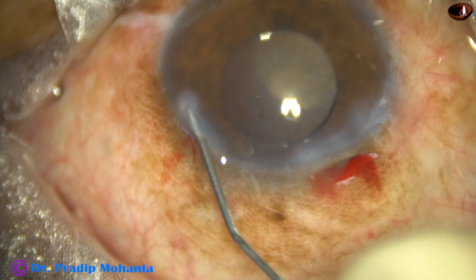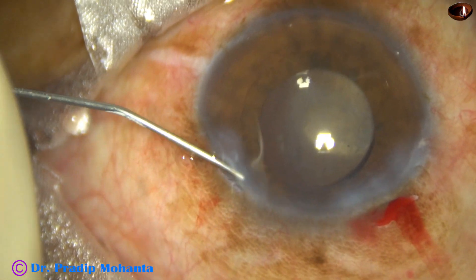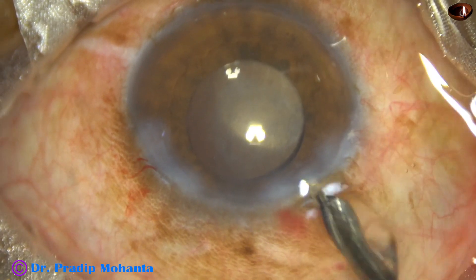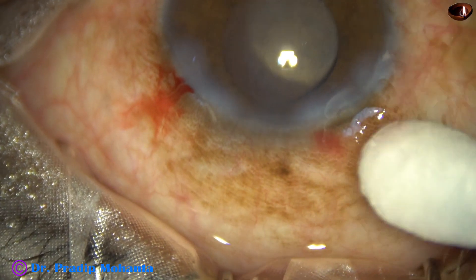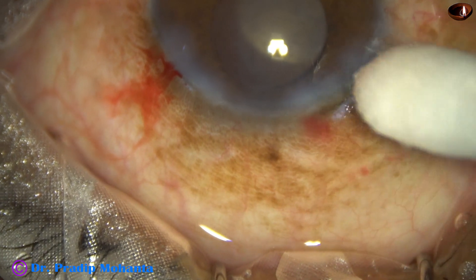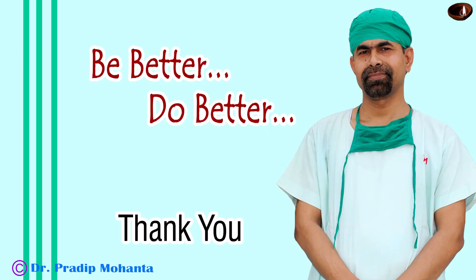The side port is closed by hydrating the corneal stroma on either side of the side port. And now this is the final lavage of the anterior chamber. The integrity of the wound is checked — there is no leakage. The case is concluded. Thank you very much for your attention. Hope this video will help you in developing your surgical skills. Be a great surgeon and serve your patients with love, respect, empathy, and great surgical competence.